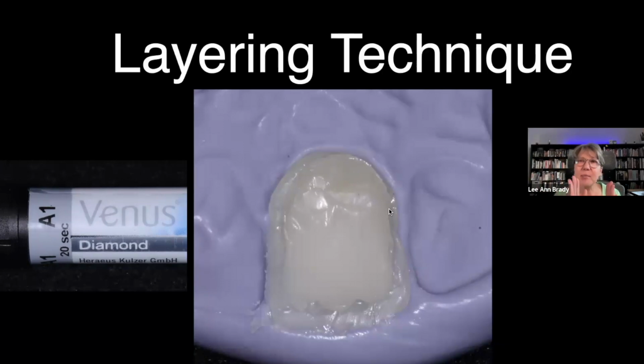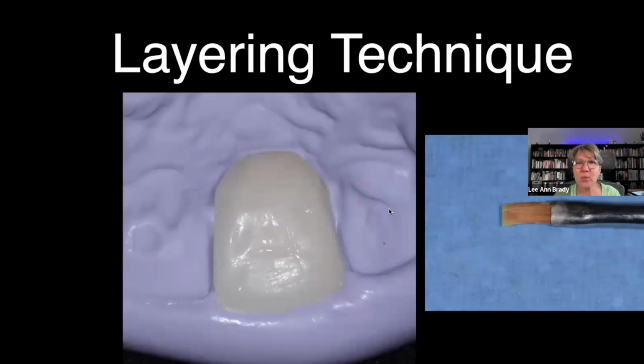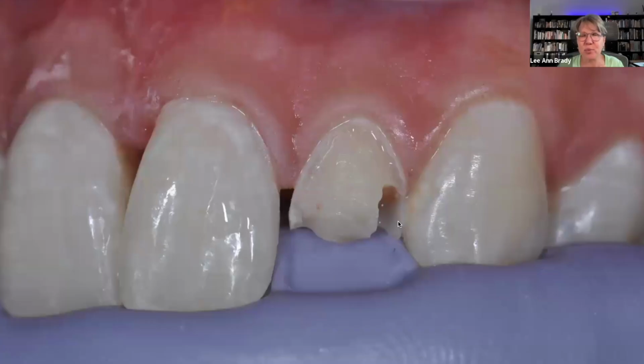I'm building in my dentin toward the center of the tooth, the center of the cavity prep, and the last thing I'm going to do is make sure that I pack composite or place composite against that mylar strip so that I'm building that contact in an enamel shaded translucent composite, which is then the last layer that we're going to apply over the top and into the interproximals. So now we've got these layers that replicate what's happening from a natural tooth perspective.